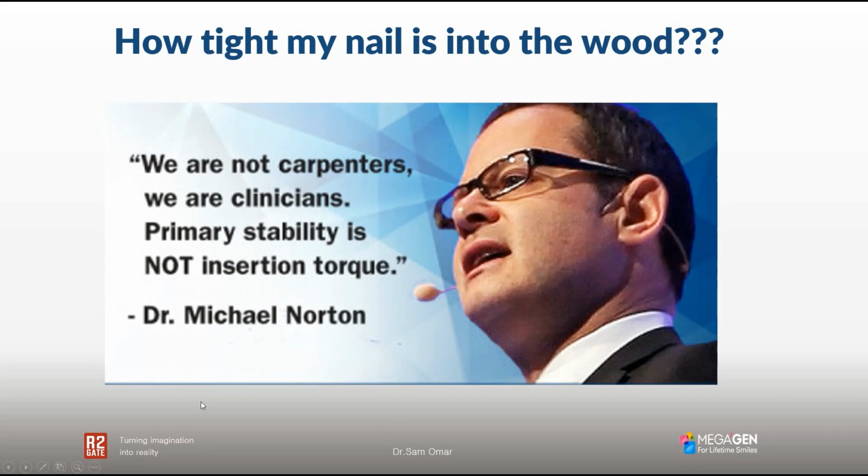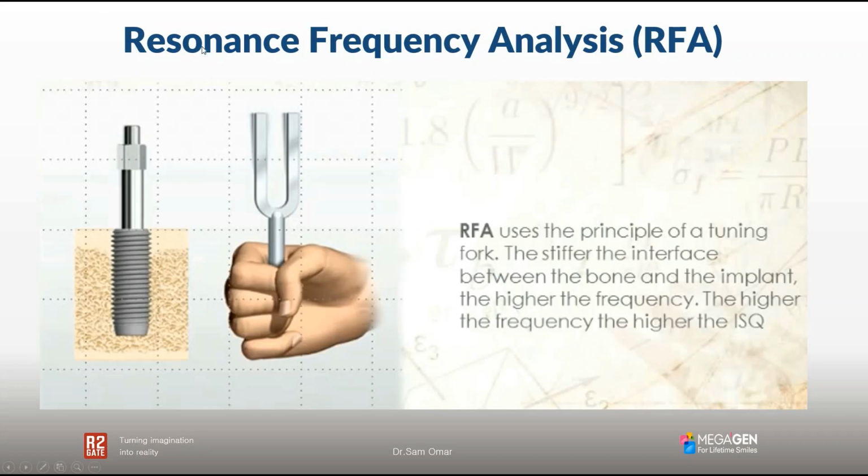Michael Norton, whose slides I'm borrowing a lot from today, said, we're not carpenters, we're clinicians, and primary stability is not only insertion torque. So, what else? There's also the concept of resonance frequency analysis. So what is resonance frequency analysis?